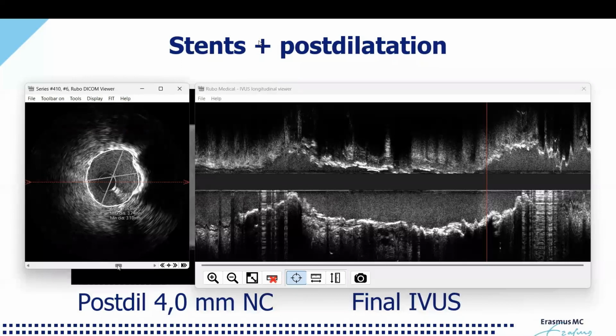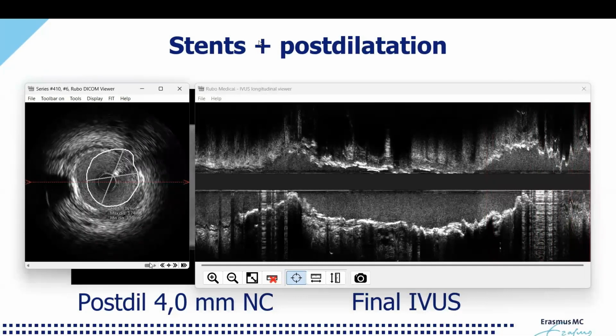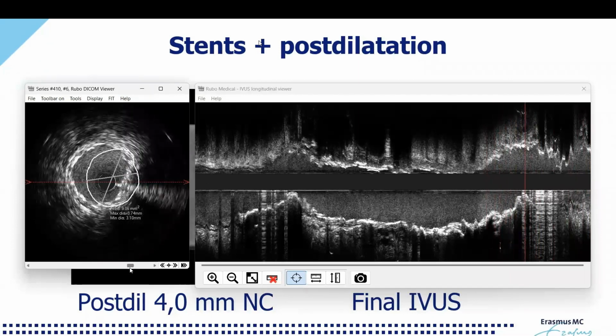There was a question on, should we decide stent size from IVUS parameters? The answer is absolutely yes. Yeah. Within this edition of today, we're focusing on calcium, how the plaque modifies, how the minimal stent area changes. In the previous editions, which are all available on YouTube and on the website of ACIST, you can look at our editions in which we focus on sizing.